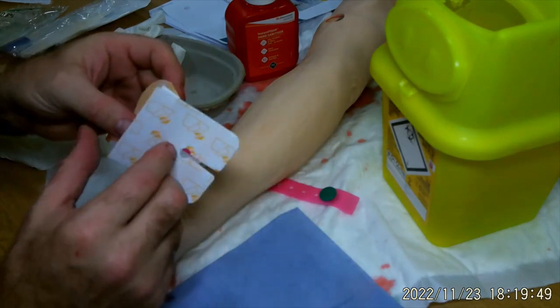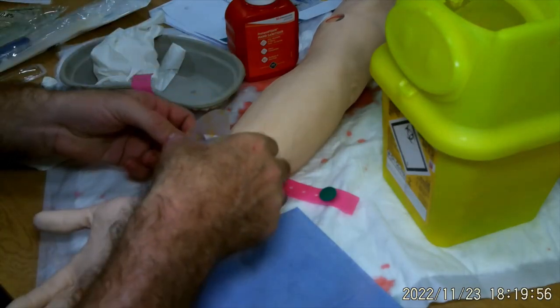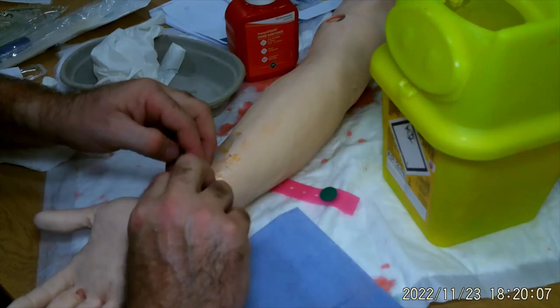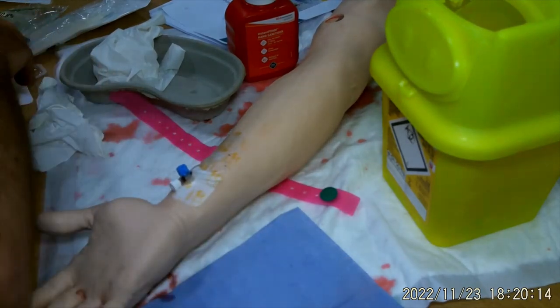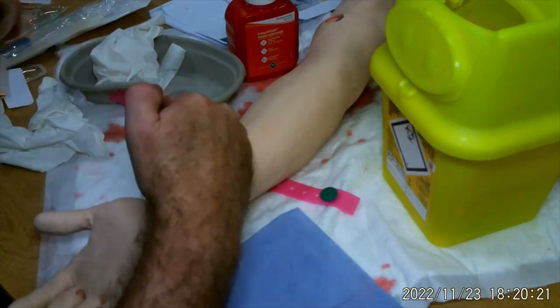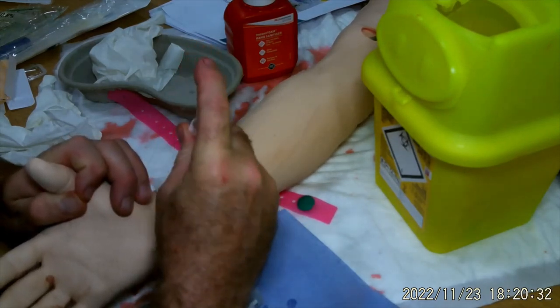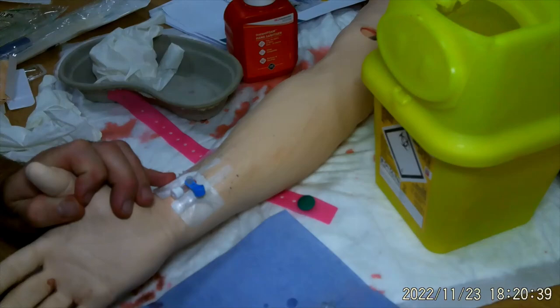There are lots of numbers on these ones. Take number one off first, place that over the top, stick that down. We can then lift that up to do number two and stick that all down neatly. We've then got number three and four. Once that's all stuck down, we can peel this from the top and peel that away. You can see nicely where the cannula enters into the skin. I'm now going to get my flush and that will go into the port at the top — just a little flush to clear the port is more than enough. We know that cannula is in and good.